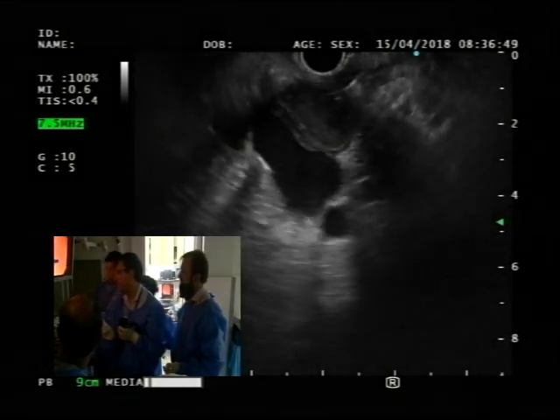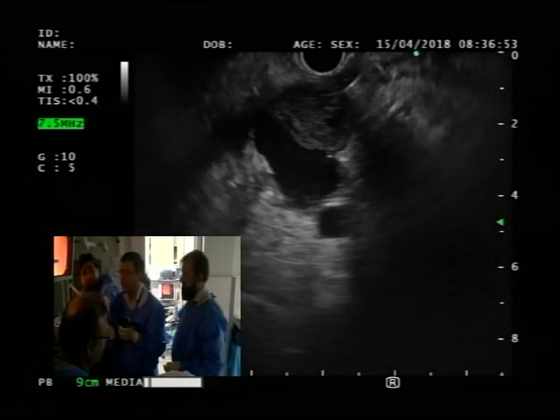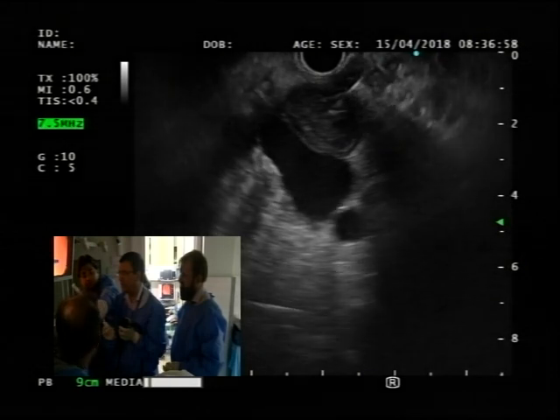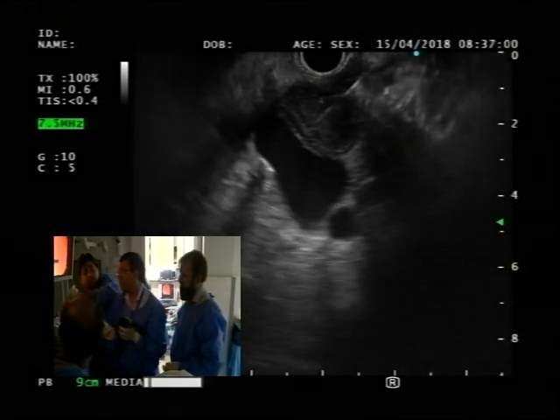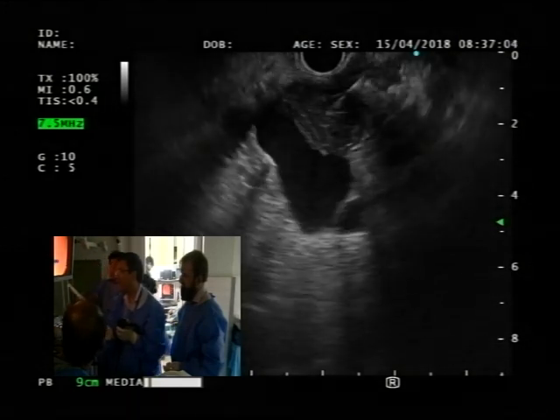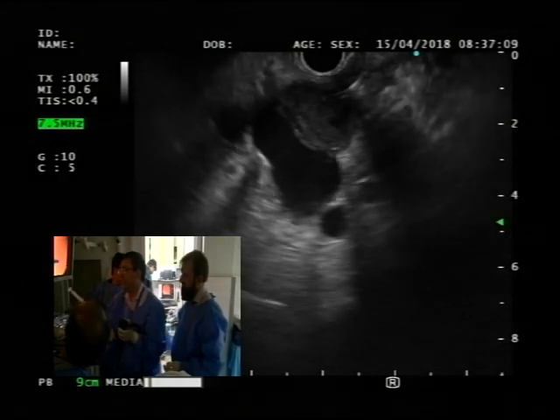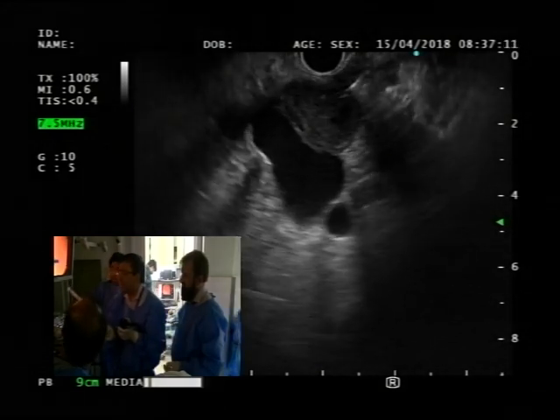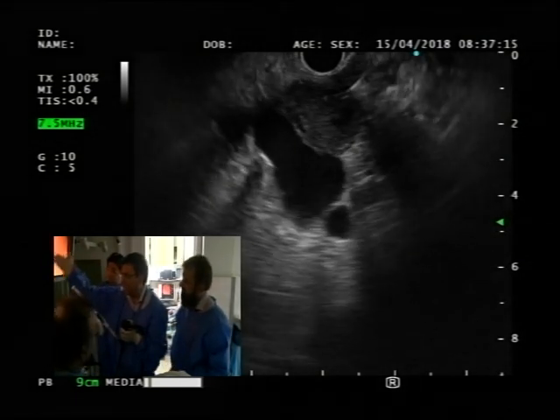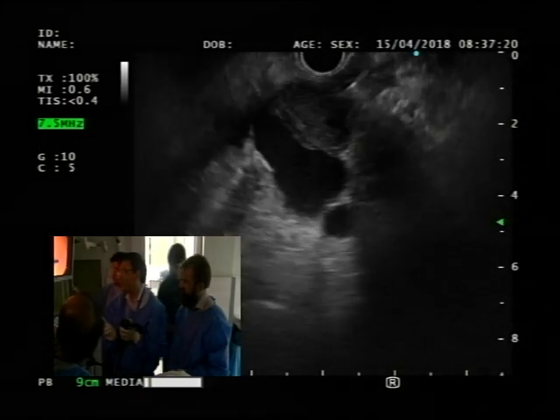Khalid, you see that I decided to do FNA. Mrs. Riyaz has just reviewed the CT scan and she says this feels like a clot. It is a clot even by doing an FNA. It's very soft, easy going in. I can see that it's a clot just by looking at it. I believe it's a clot the moment you said that.